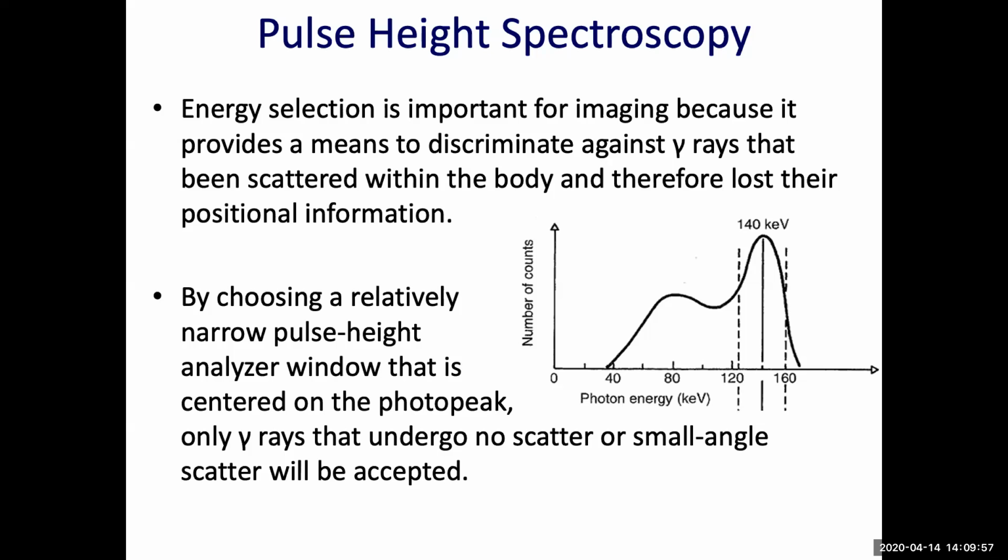When they designed the collimator, they designed it just to define the direction, like a kind of lens, and accept only the photons perpendicular to the crystal. But by the way, it also reduces the number of scatter and also reduces the true events.